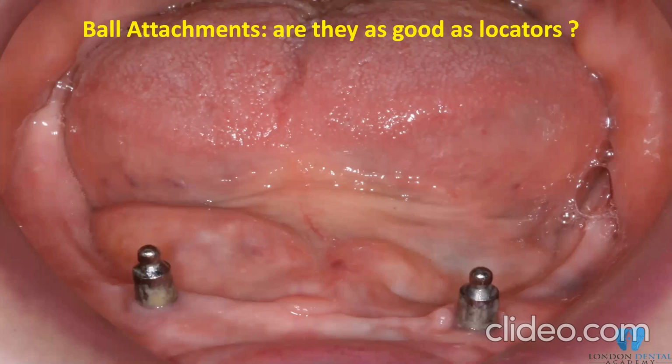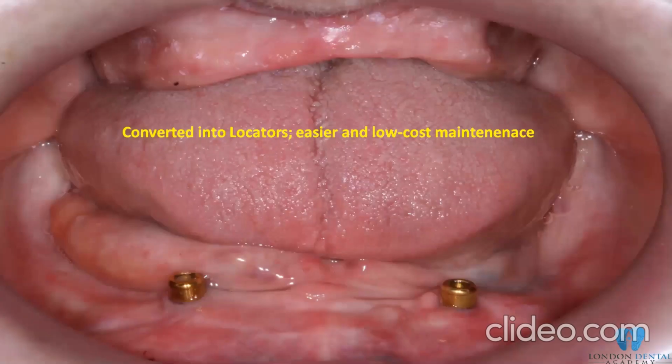Therefore, you have got 2 options here. Option A, either to change the ball attachment into new ball attachments, and that will make it easy for you. But again, you have to change the denture, or change this into something else. And you've got many options. I would not discuss anything now because I think it's quite limited time. So what I decided to do is just go for a simple solution, changing them into locator abutments.